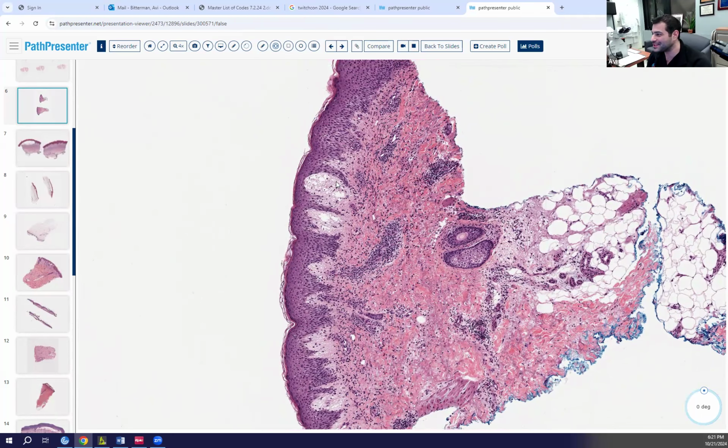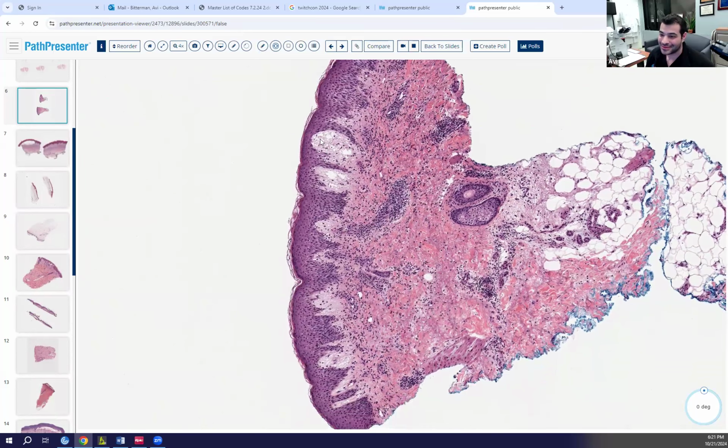Just because we're in a chapter doesn't mean everything's going to be a split. Remember, I gave you things that weren't splits, right? I gave you acantholytic dyskeratotic processes. So good. Papillary dermal edema. We all agree, right? We see that. Yes? Papillary dermal edema. Not a question.